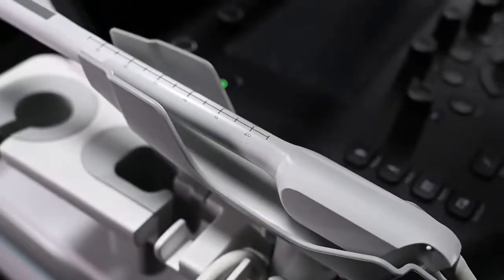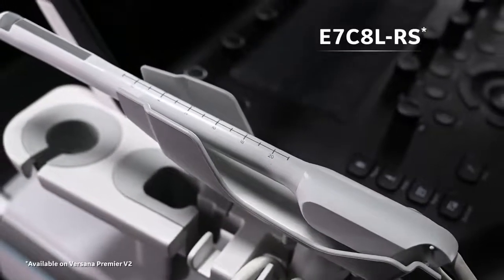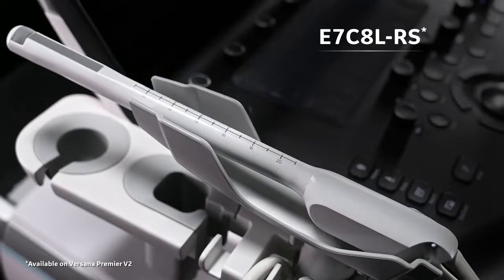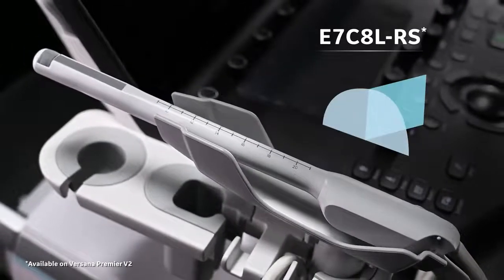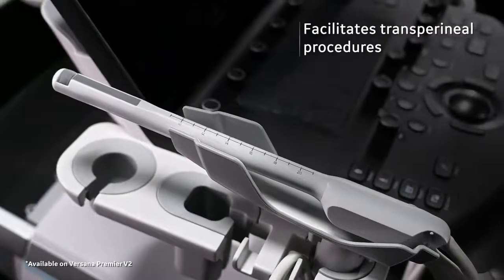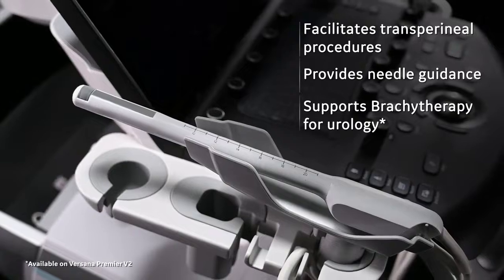The Versana Premier probe family welcomes E7C8L, a new biplane endocavitary probe that enables independent views of the transverse and sagittal planes. It also facilitates transperineal procedures, provides needle guidance, and supports brachytherapy for urology.